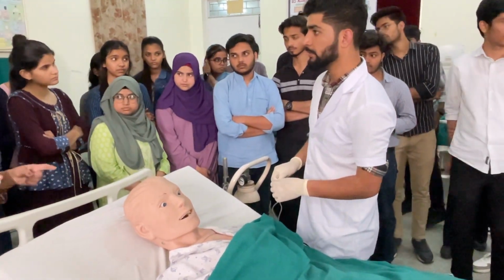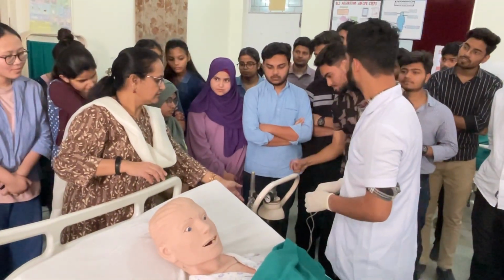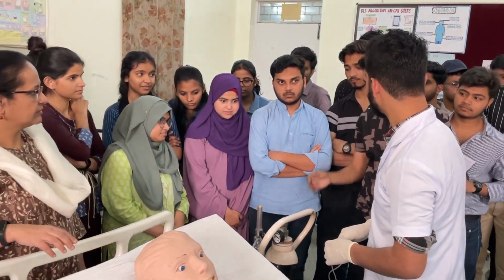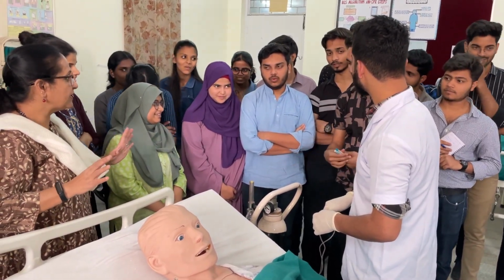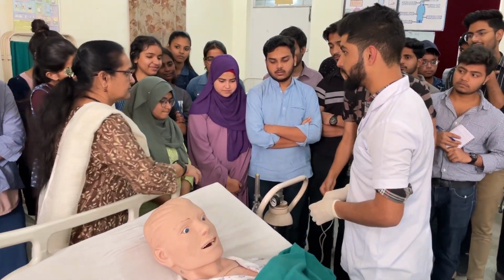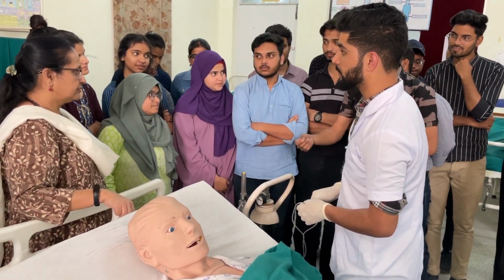Adi, what is this? Come here. What is this? And this? No, meter, flow meter. Flow meter, ma'am. This is the regulator and this is the flow meter. I have asked only this. And what is the purpose of this humidifier? Moisture, ma'am.